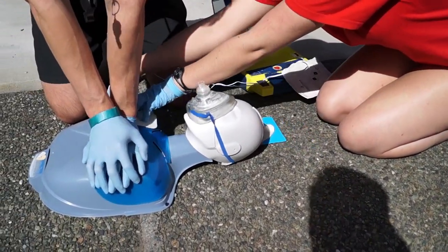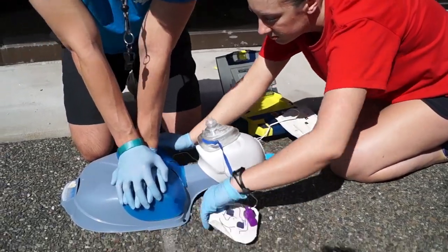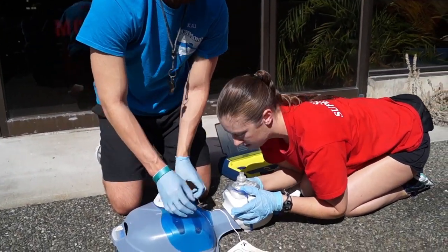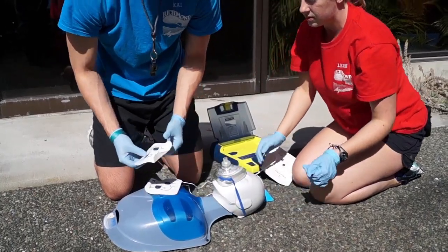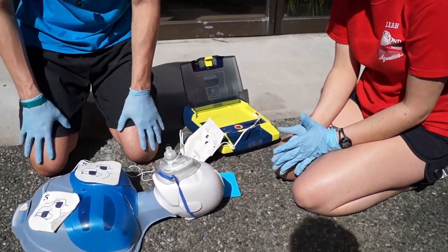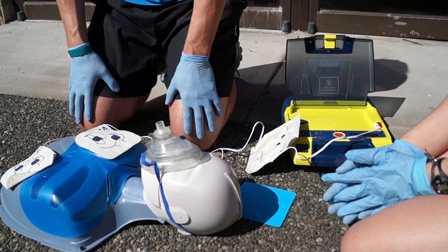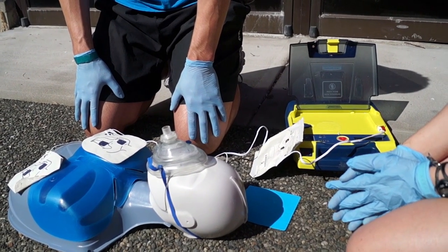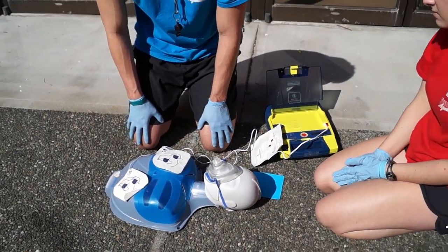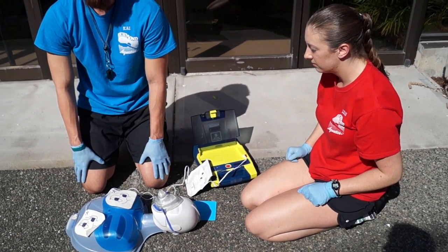Tear open the package and remove pads. Peel one pad from plastic liner. Place one pad on bare upper chest. Peel second pad and place on bare lower chest as shown.